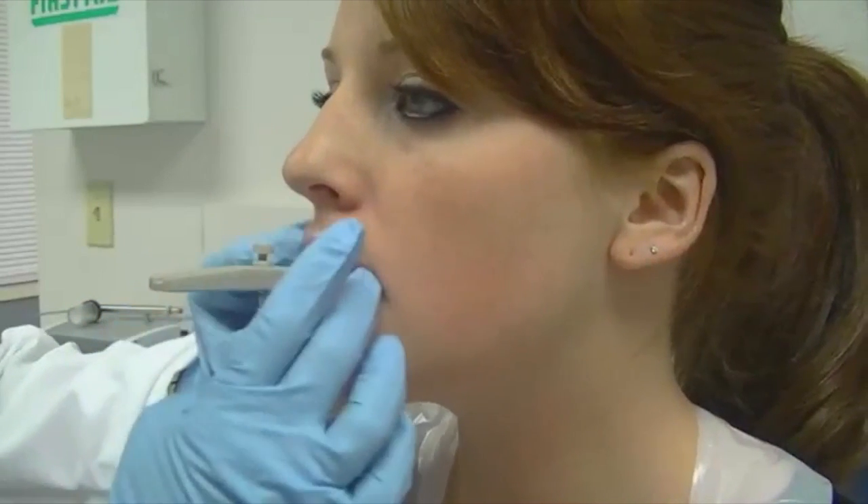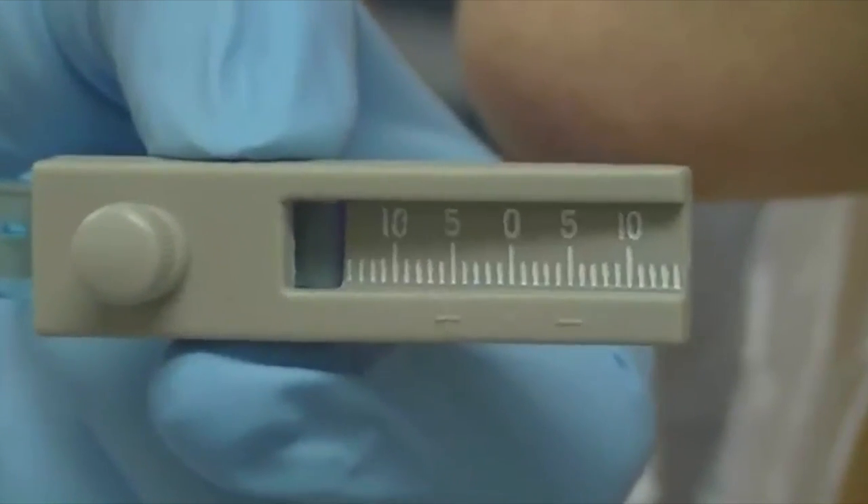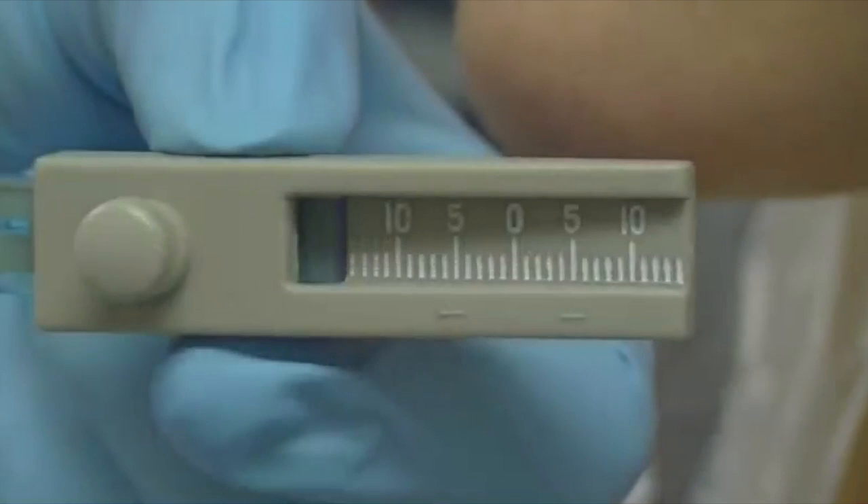On the white fork you'll see a little indentation or etching that will help you line up your midlines. You'll notice on the gauge itself a plus and a minus that is even with a 0 to 10 scale on both sides.